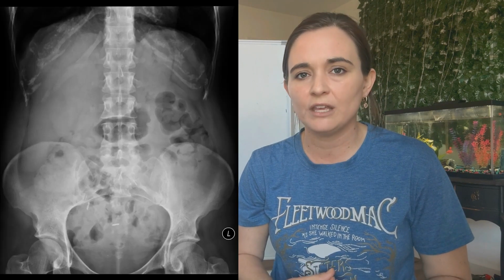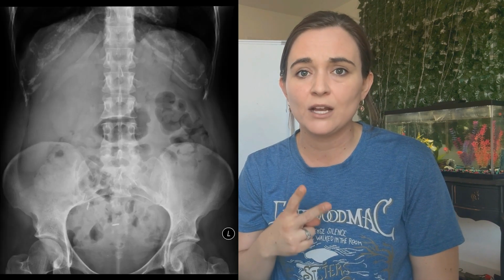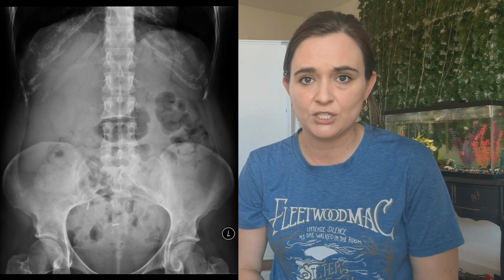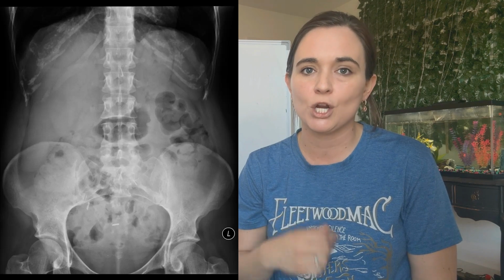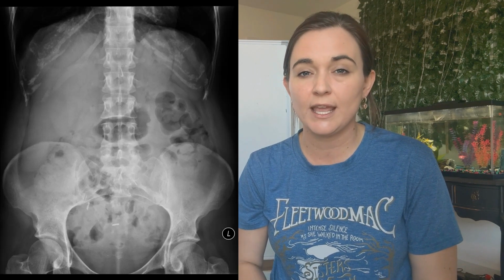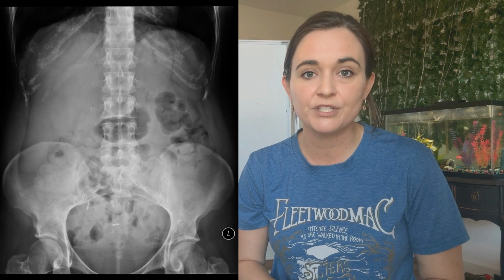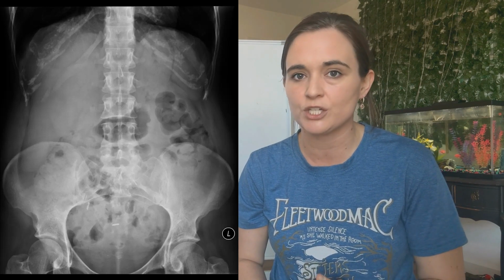Now, what are we looking for? Air fluid levels in the intestines, a black crescent of free air under the diaphragm, shifts in organ position or loops of dilated bowel, and again, markers, anatomy coverage, and exposure quality. Don't forget to include both diaphragms. Clipping them defeats the purpose of this projection.